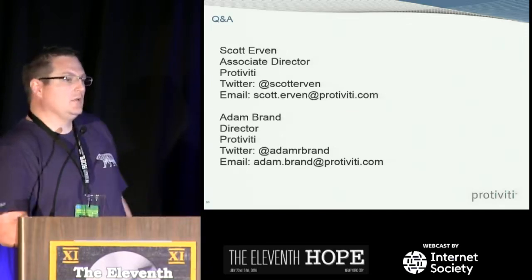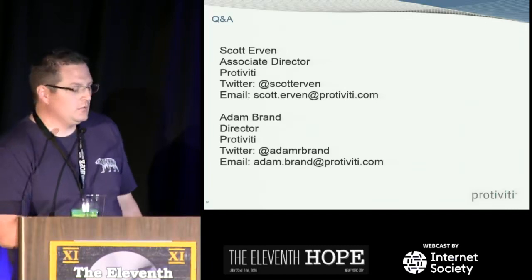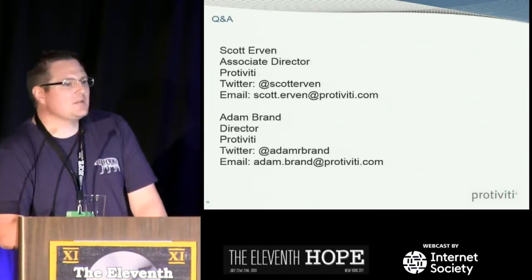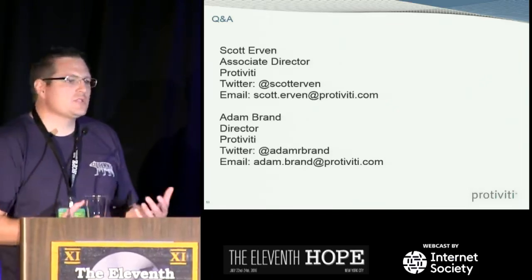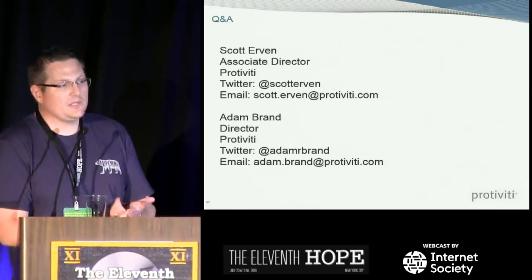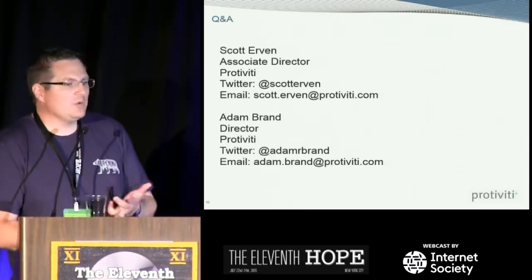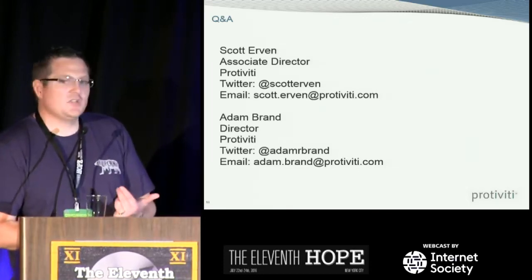You didn't find any attempts at attacks on individuals who are in hospital, which I would expect to see at some point? I mean, you can think about targeted attacks, but I think it's important to look at that can happen. But I'm more concerned, honestly, with unintentional consequences. So how do we have low assurance because these devices lack forensic logging capabilities in many cases, or forensically sound evidence capture? How do we know that malware that we see that was meant to steal credit card data didn't cause a configuration change?